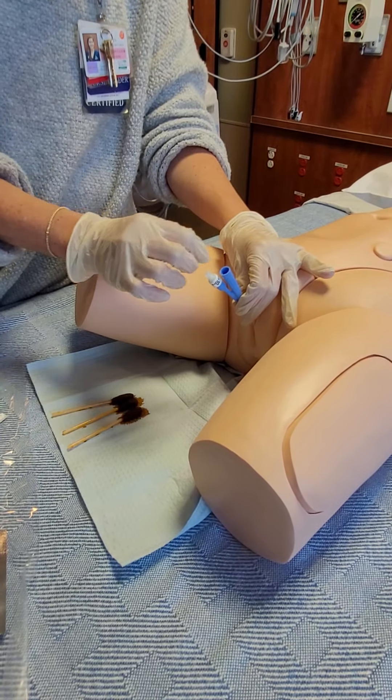Then you're going to tape it to your patient — the IR tech will have tape there for you. With a 10-year-old, you can just put a couple pieces of tape and let them do the procedure. With younger kids, especially babies, I end up donning the apron and staying here, holding the catheter in. Because as they're crying and getting more upset, there's no balloon inflating into the Foley to keep it in place and they can push it out. That will save you a trip upstairs to grab a new Foley.